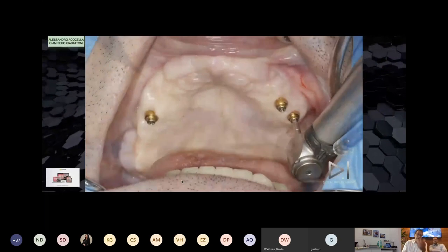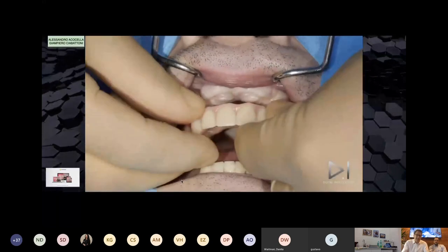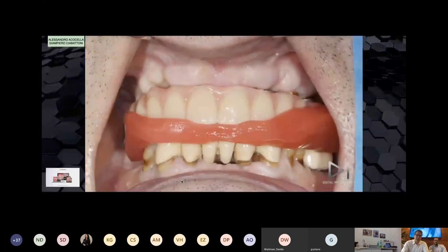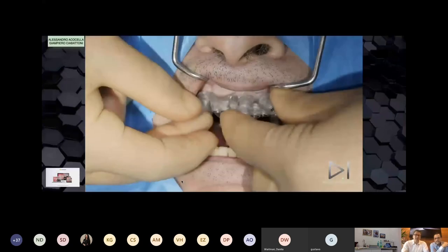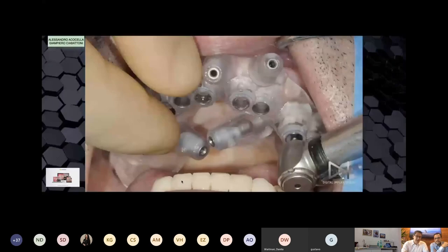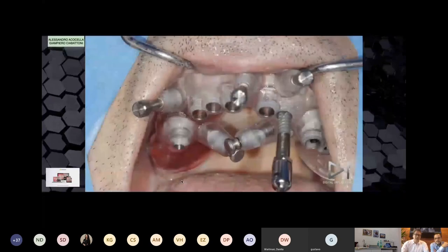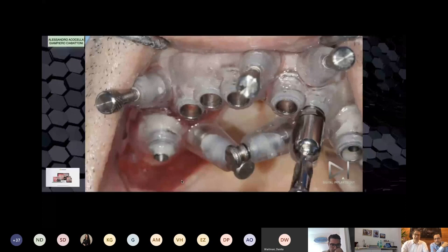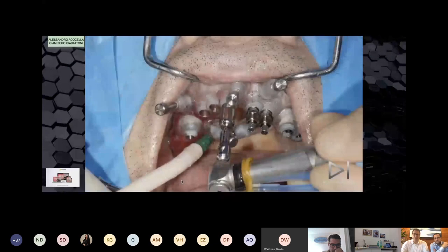We change the abutment, we insert the new abutment. We can try the new occlusion before the surgery. We can insert the final rehabilitation directly on the free implant already in the mouth. At the same time, we can fix our guide to the implant with the screw, and now we have the best situation. One guide with perfect screw retention to the implant, we can insert the implant, in this case, a Neo implant, very quiet. No, this is an SPI implant, sorry.